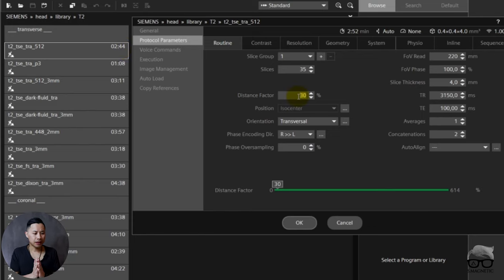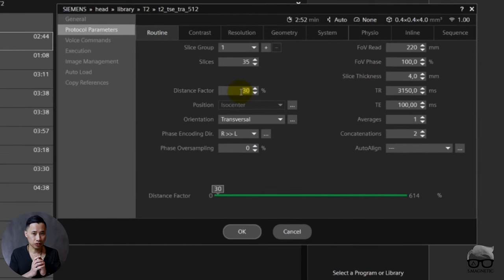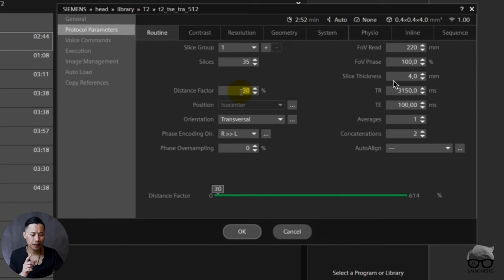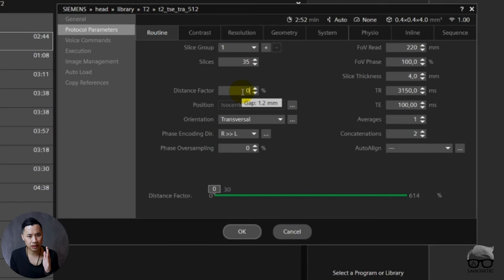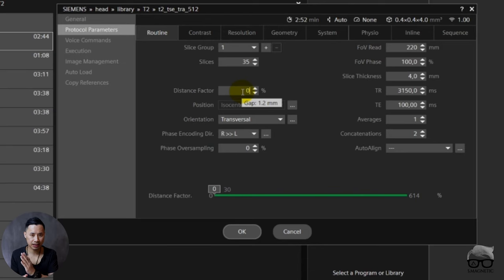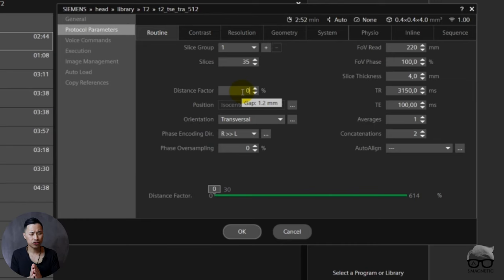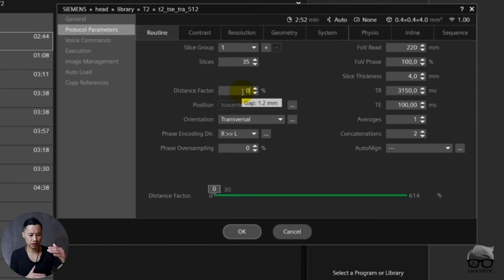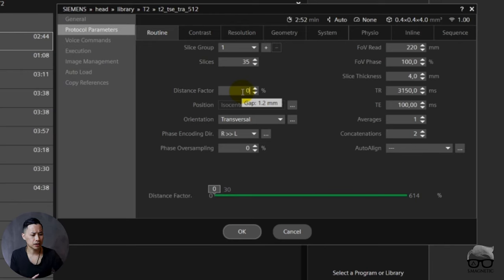The thing about concats is you can use this also like this: distance factor is very important when it comes to concatenations. I have 30% distance factor now out of 4 millimeter slice thickness. This means 30% is 1.2 millimeter gap. 1.2 millimeter gap is a missing part between each slice, a gap between each of my slices. If you want to image a small structure, a tumor which is very small, you should have at least zero gap because you don't want to miss anything in between. Or if you're going to image a long bone or a big structure, you can have a little bit gap which is okay because you have to cover a lot.